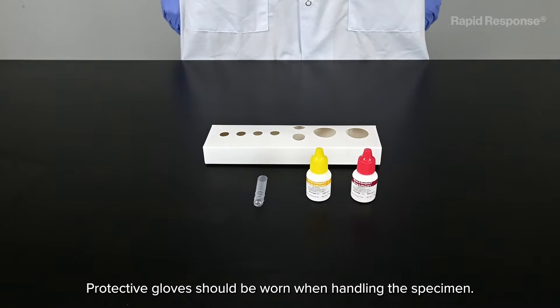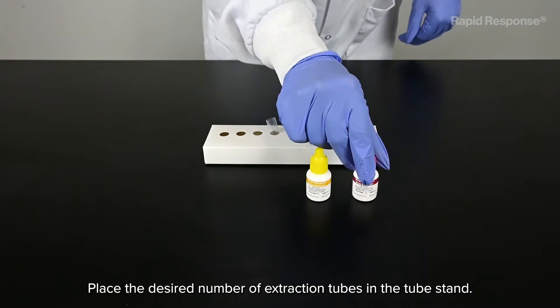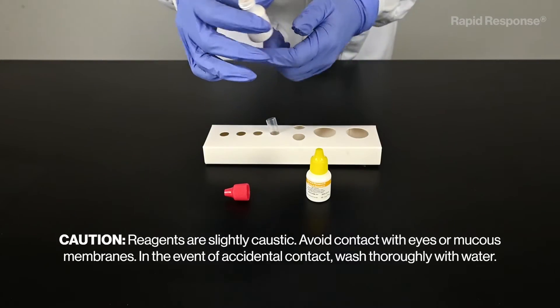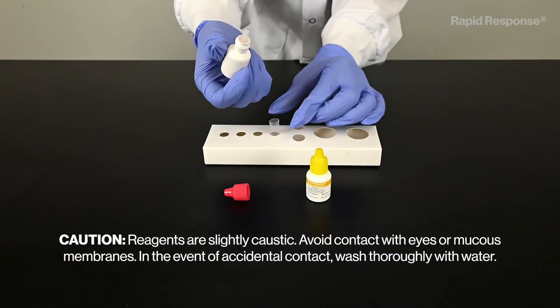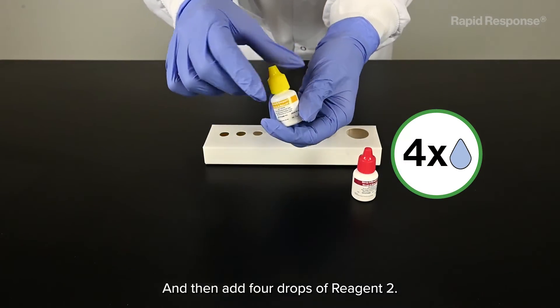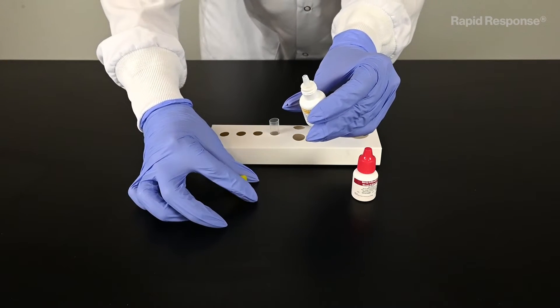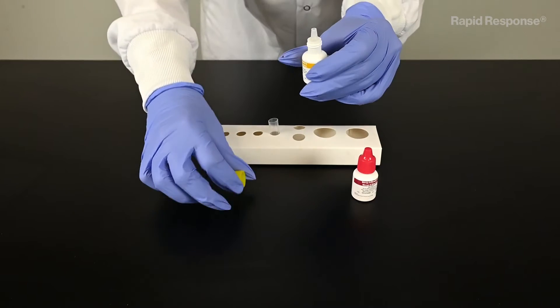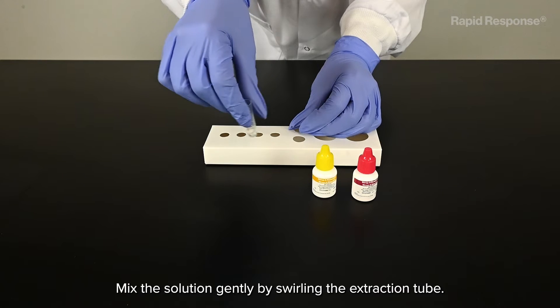Protective gloves should be worn when handling the specimen. Place the desired number of extraction tubes in the tube stand. Add four drops of Reagent 1 to the extraction tube, and then add four drops of Reagent 2. Mix the solution gently by swirling the extraction tube.